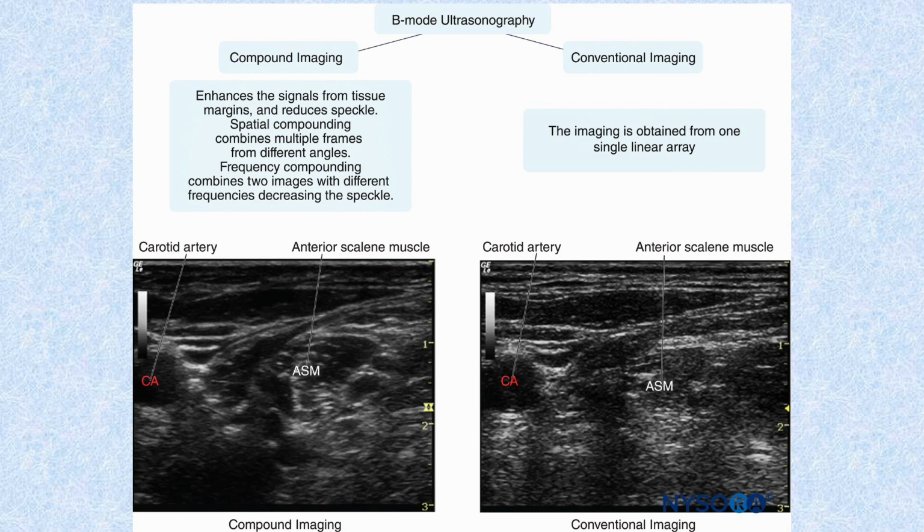So this slide, I just want to illustrate that nowadays certain ultrasound machines have a modality called compound imaging. Compound imaging is just that the ultrasound will filter out noisy images. Noisy images means the image that is too bright or too dark. For example, this image has no compound imaging. The image is very rough, sandy-like. Some ultrasound with compound imaging will automatically make the image nicer, sharper, and increase the resolution.